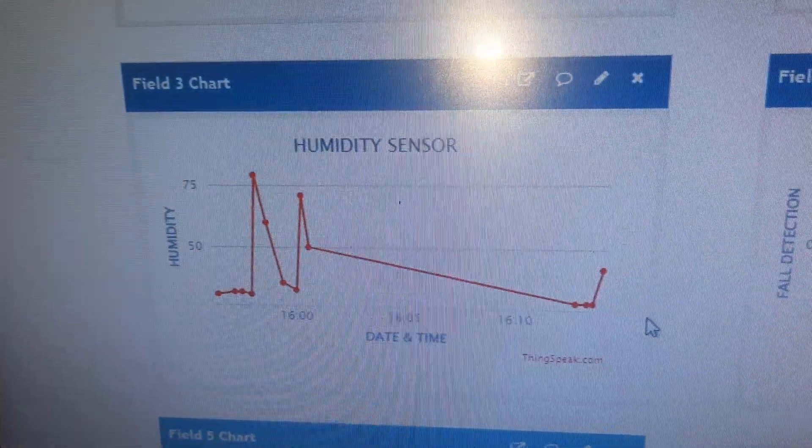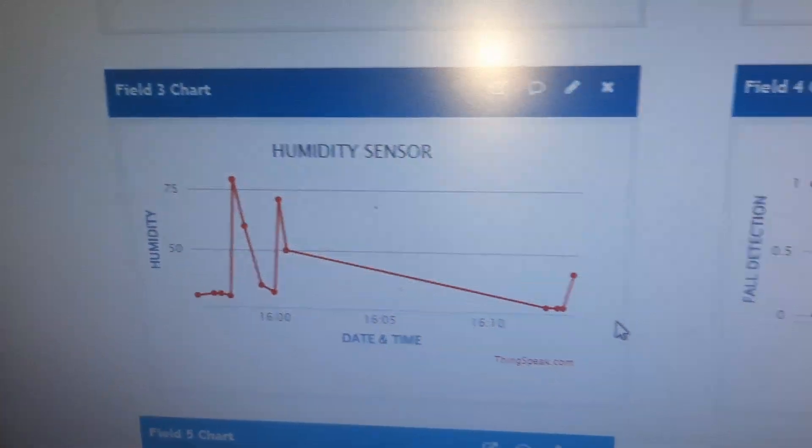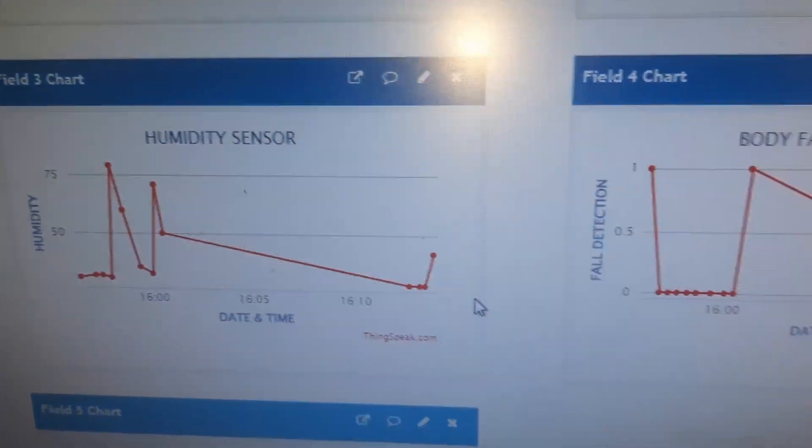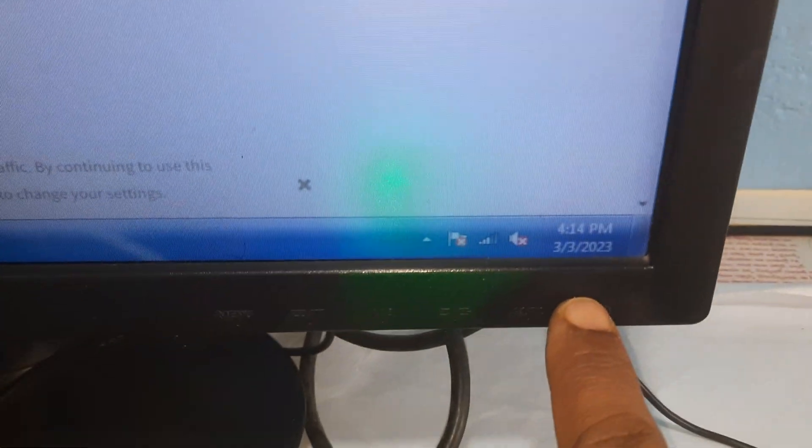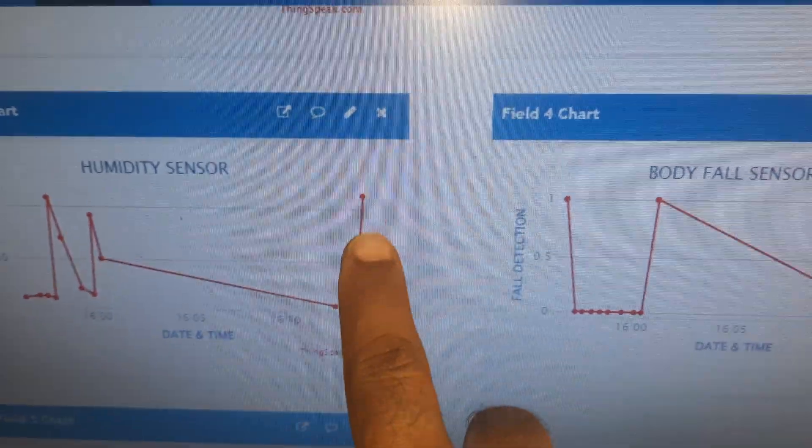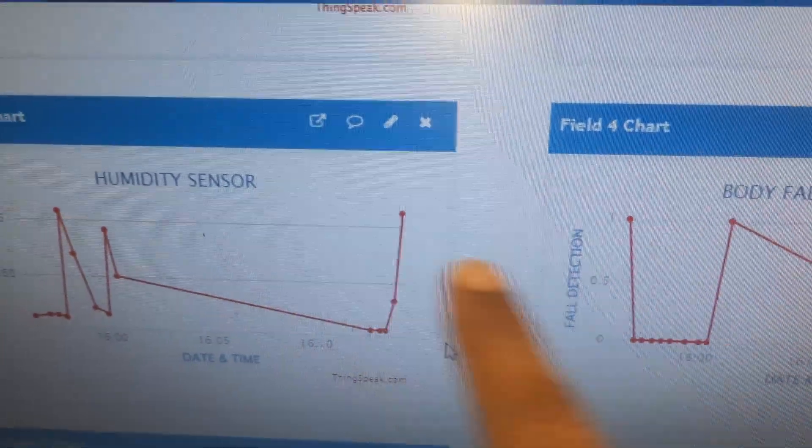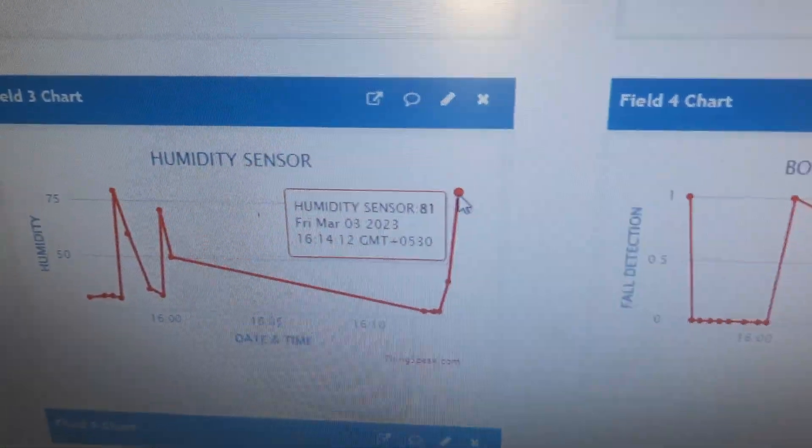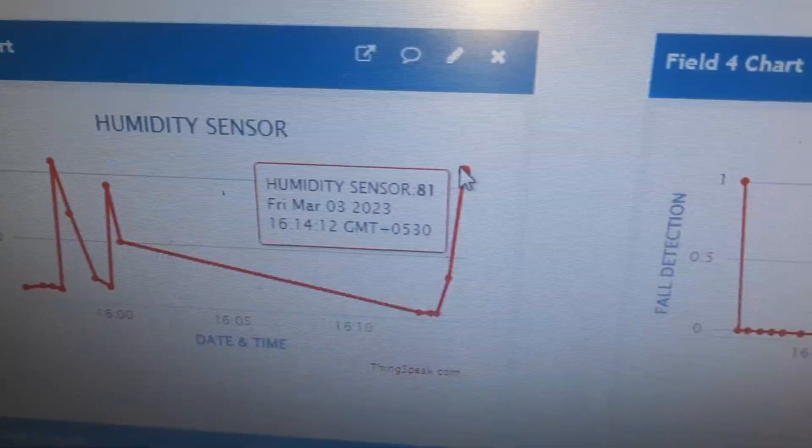Now it is updating the date and time. The time is 4:14. It has updated the 81 value.